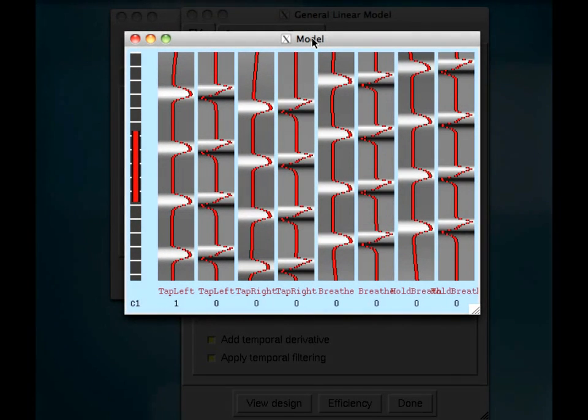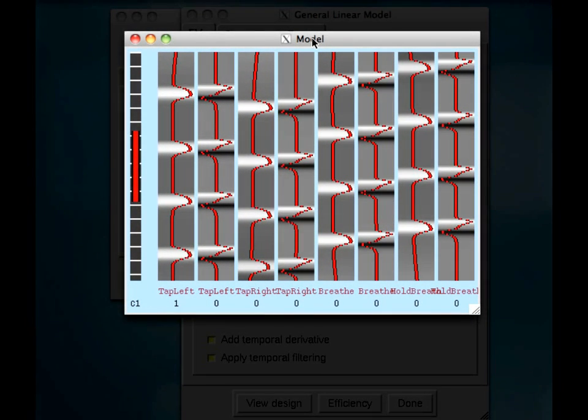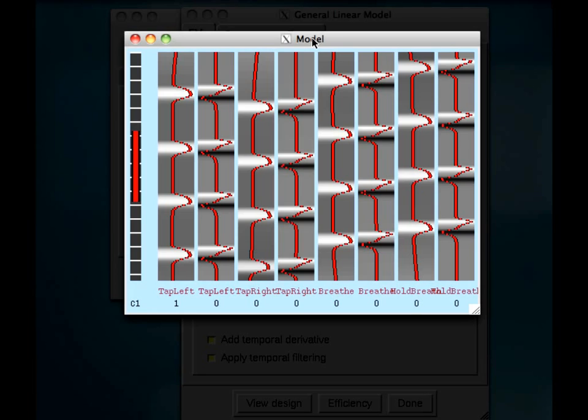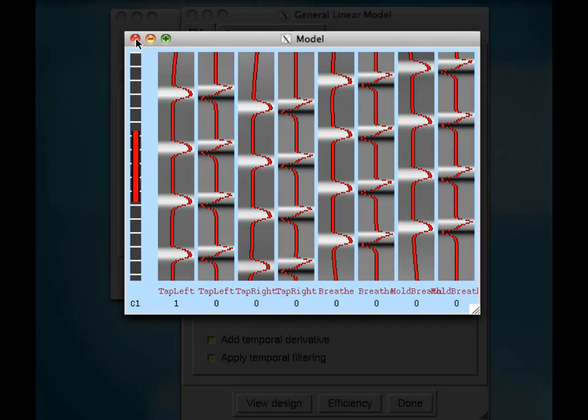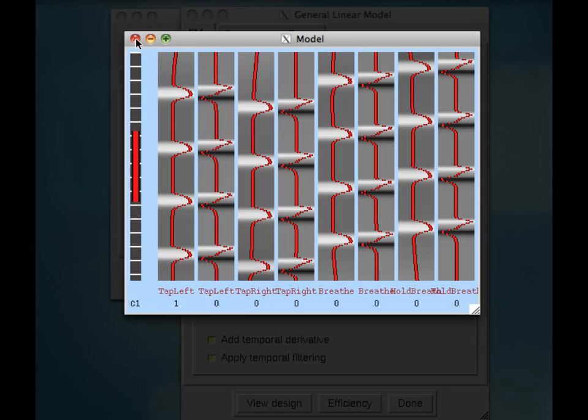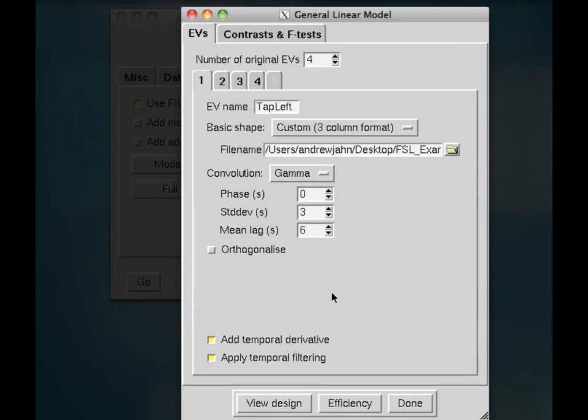So after we have all those done, click on View Design. So we have eight columns here because there are four conditions, and each one has also a temporal derivative applied to it, which also needs to be estimated. So, again, this design is just for you to look at and make sure it looks fine, make sure it looks reasonable, and I know from the timing files and from the experimental paradigm that this looks like what it should look like.